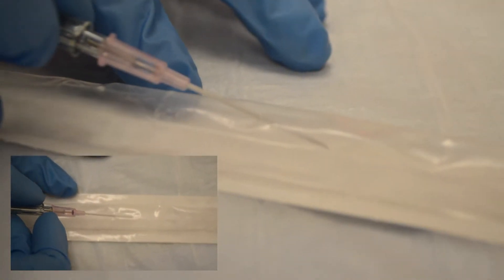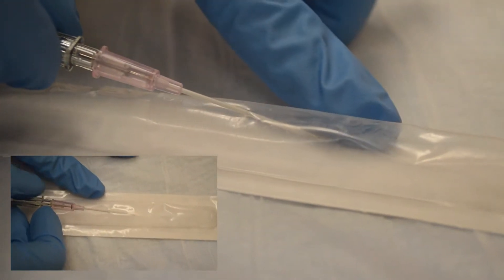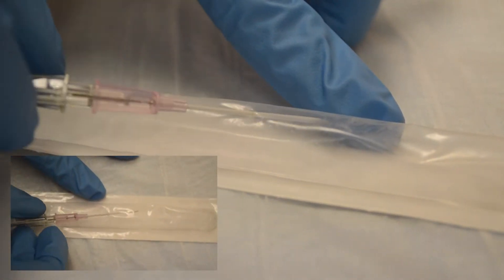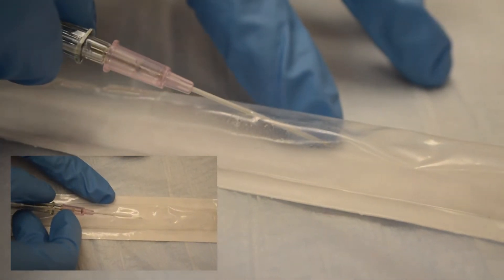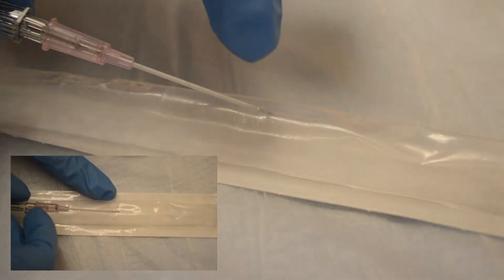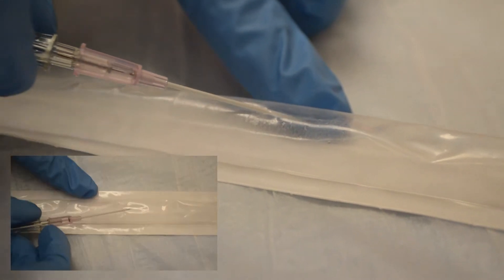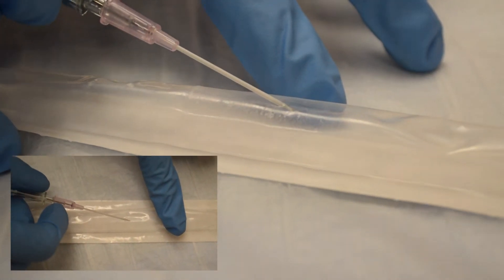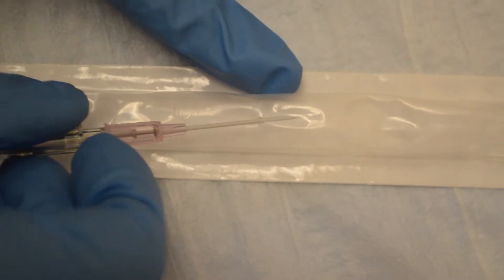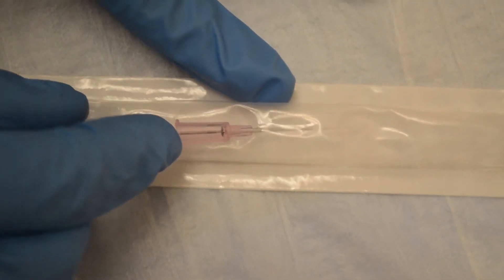So let's say we've poked and we're underneath the skin and our vein is all the way over here. Instead of moving the needle sideways with half of it still in — think about how much skin and tissue you're shearing and how much pain you're causing your patient — that's called fishing. What we want to do is draw the needle back until it's almost out of the surface of the skin, then move your hand to redirect, and then go back in. If we need to move again, pull back, almost out, redirect your hand, and go forward to find the vein. Press forward — we got a flash. Then flatten out, move forward, catheterize, pull out, and tamponade. No fishing.